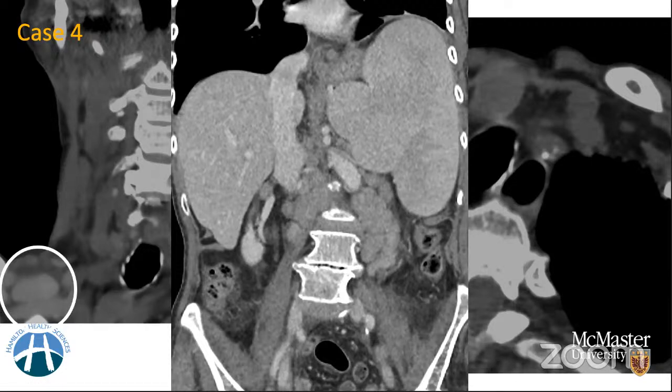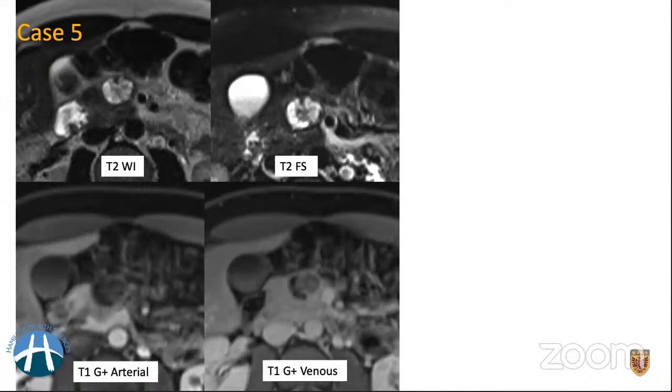So the next case, the last one, I have kept to be quite an interesting one, something which is going to be slightly difficult. So this is a 50-year-old female.